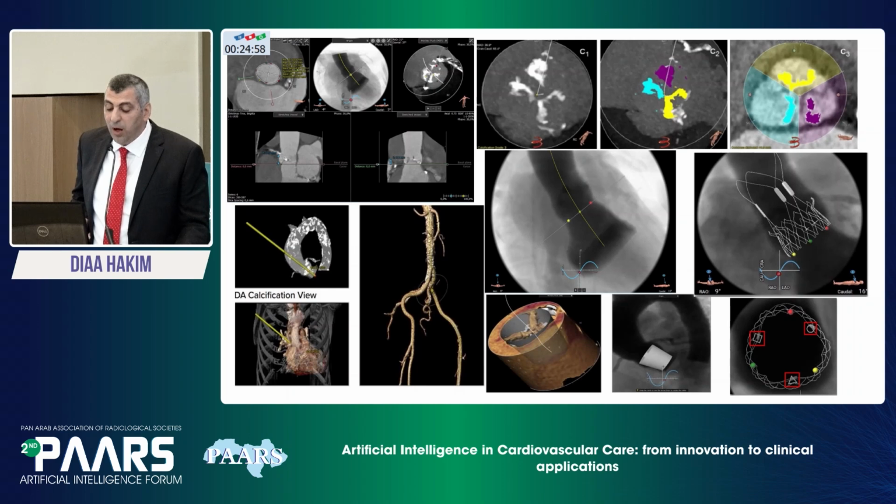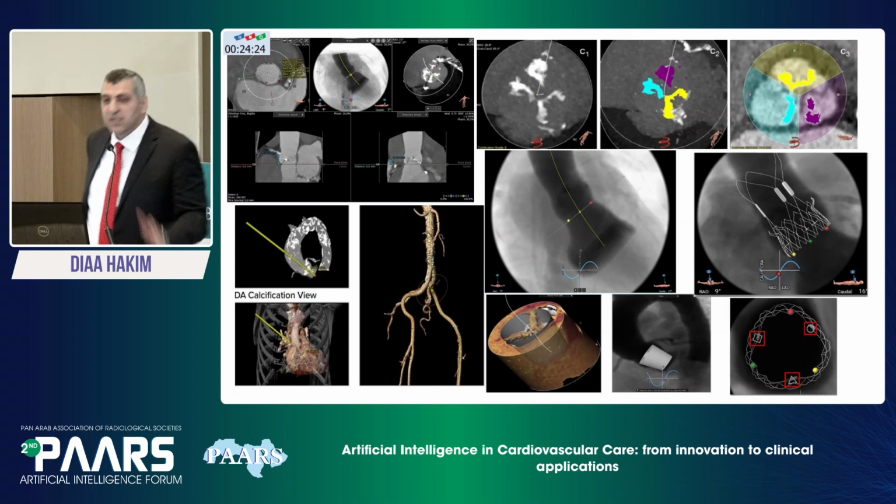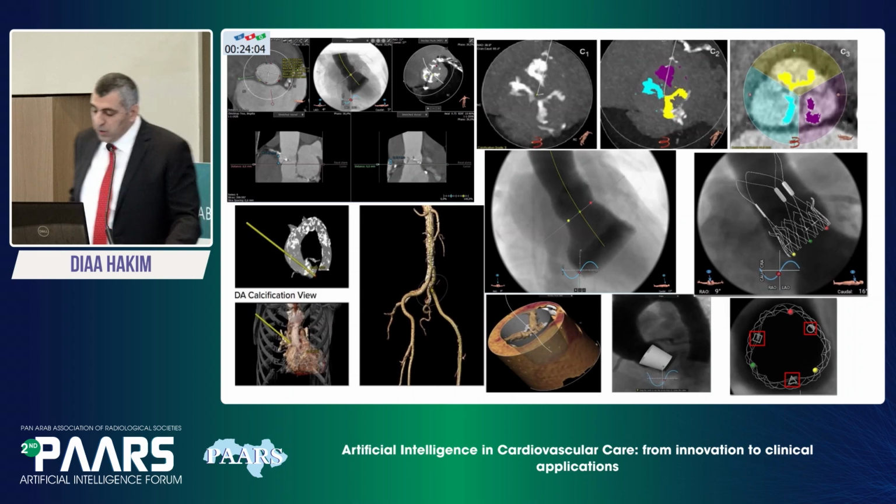The distance from the coronary arteries will also determine the complications, and it nicely depicts the aortic root to see if there is a calcification or not, also providing the peripheral vasculature, because this is the site where you're going to put your introducer to mount the catheter. Not only that, but those programs simulate the valves. As you can see here, this is the angiographic view we are providing to the interventional cardiologist, and here this is the valve. This is before bringing the patient to the cath lab. But when you pick the size of the valve, you can simulate it to see what's going to happen after you put the valve, whether it is displaced a little bit in the left ventricle, and you need to push it up or down, and you provide all this data for the operator in the cath lab to work based on that.